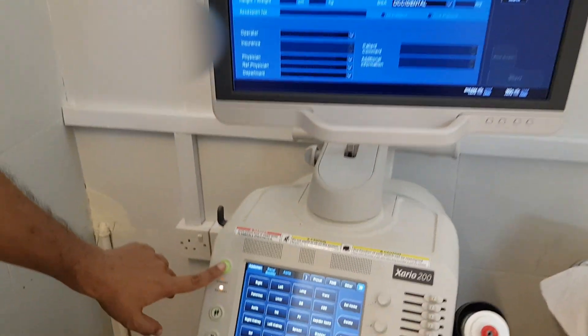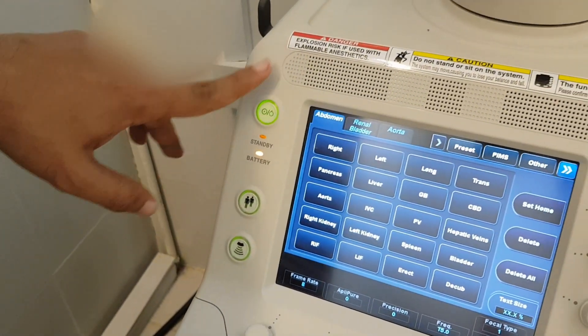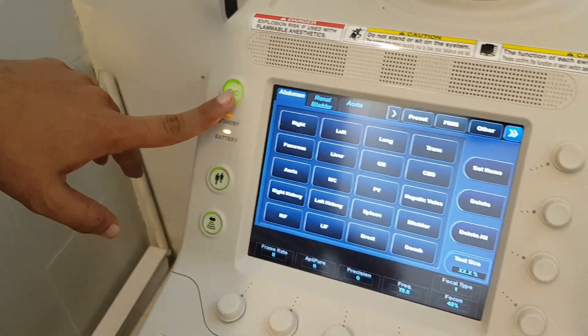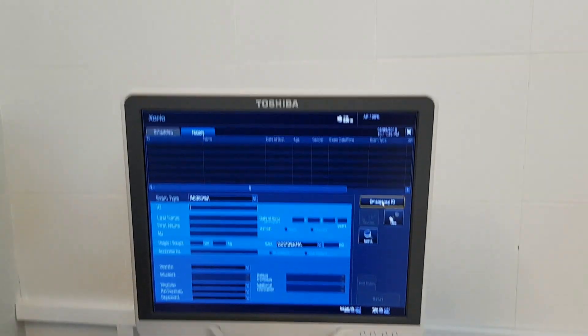This is the on-off switch. When we press it, the machine is already on, but when we press it, as the Windows loads, the software will load.